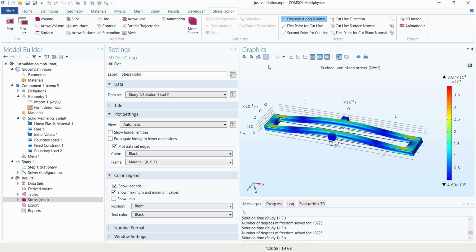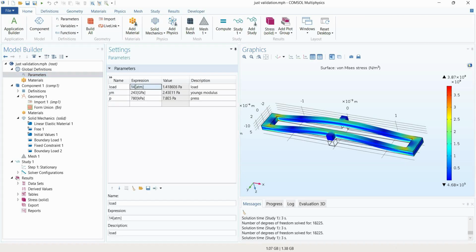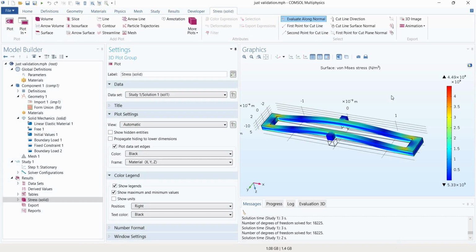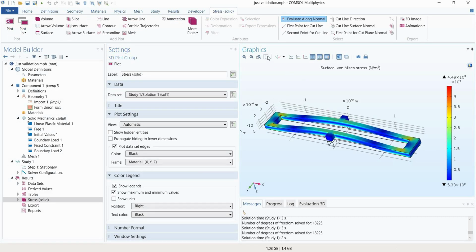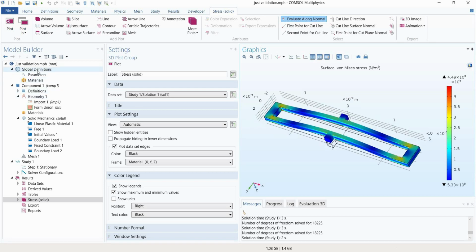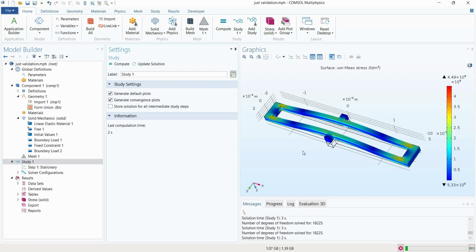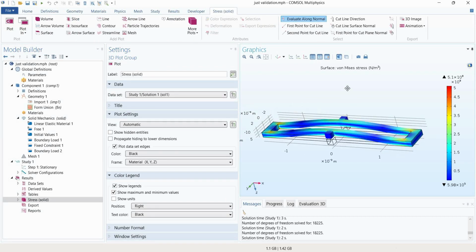If we want to see the von Mises stress for 15 atm, then we just change the value in the parameters. Just click and write 15 atm, and then click on study and then compute. So yeah, this is the von Mises stress for 15 atm pressure. And if we want to see the von Mises stress for 16 atm, just write it here, then study and then compute. So yeah, this is the von Mises stress for 16 atm.